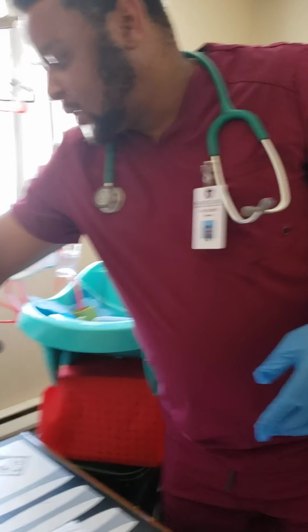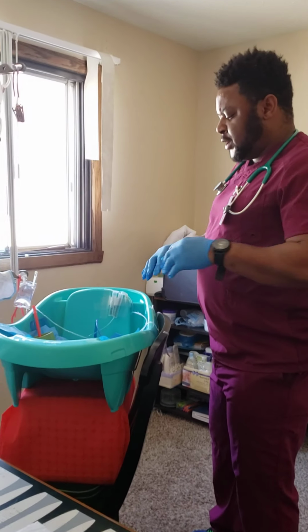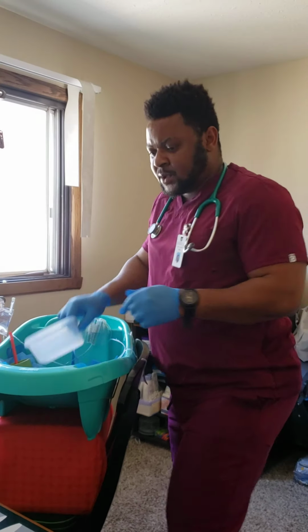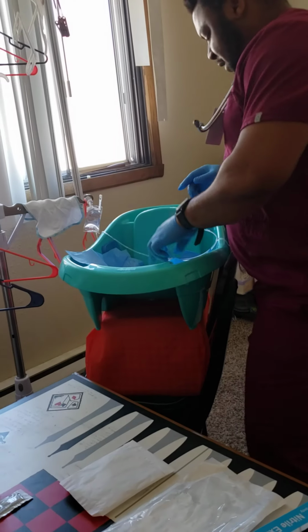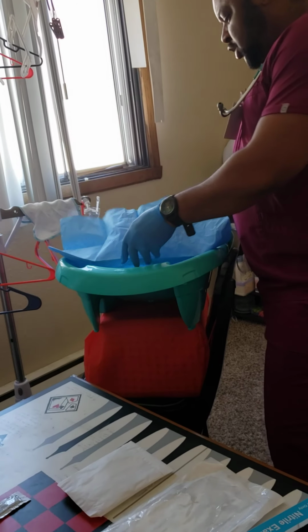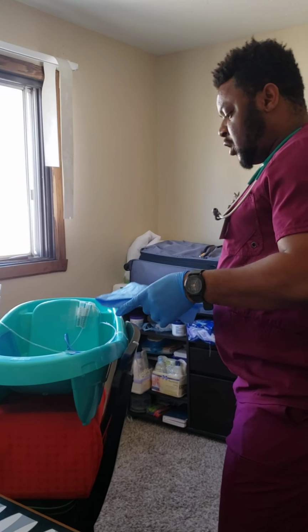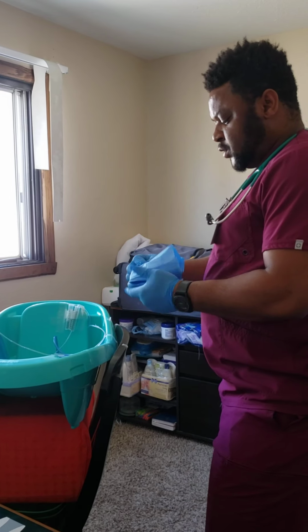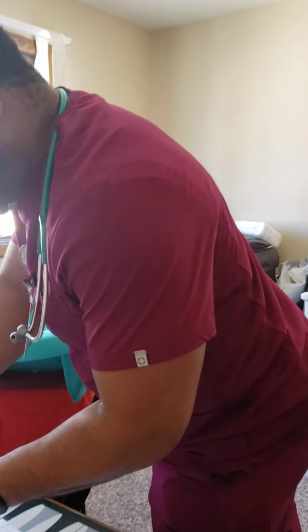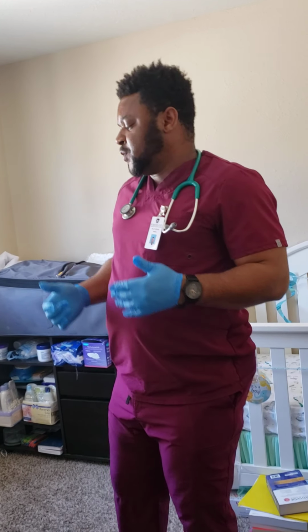And after that has been done, I will then go ahead and reassess my patient. Check again with bowel sounds. Clear my stuff all around the patient. Reassess my patient, making sure that they tolerated the procedure. And I can come back after 30 minutes to reassess them, how they are doing, and to see if there are any changes from my first assessment. So that is it for the nasogastric tube insertion.